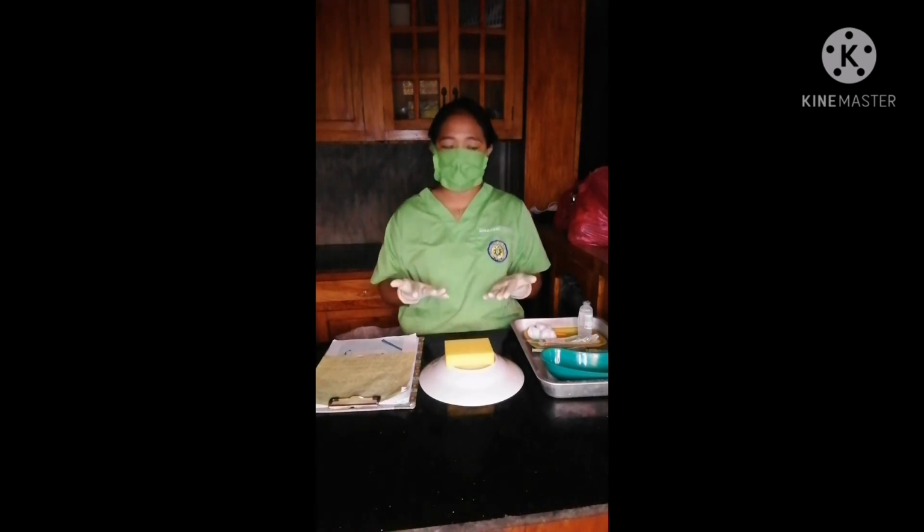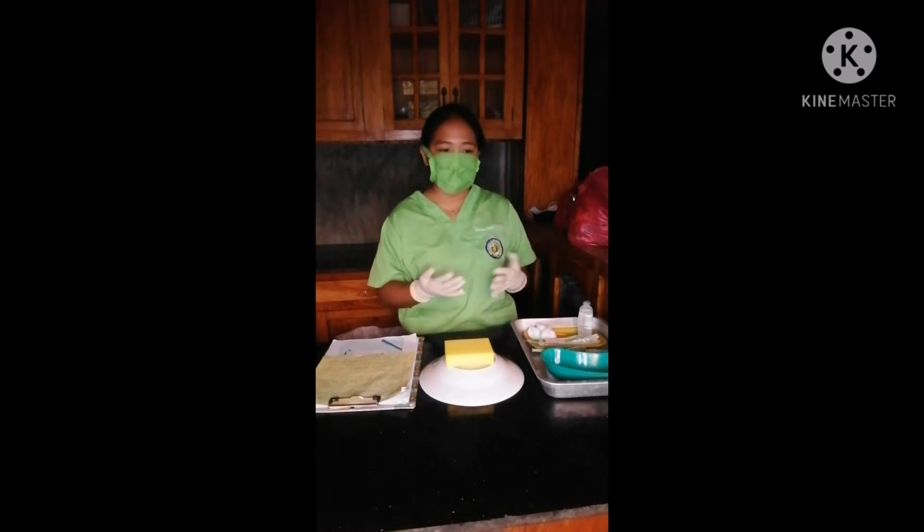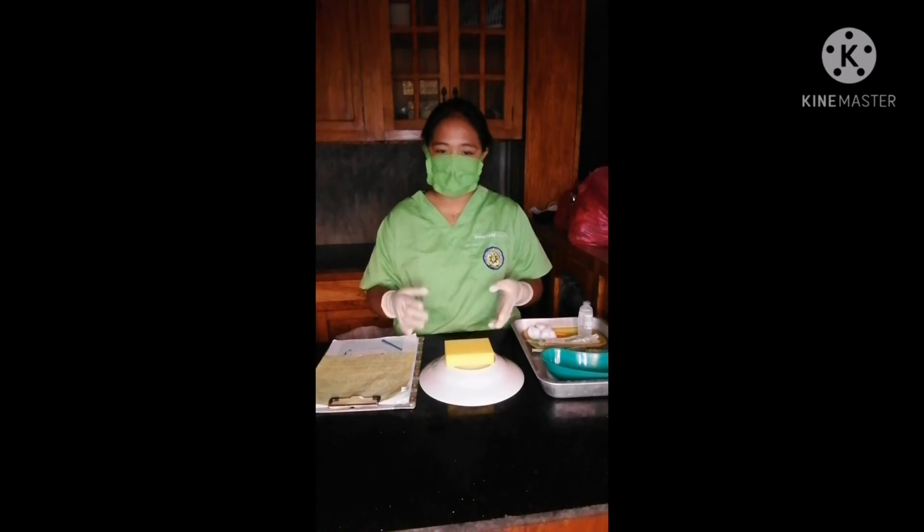Assist the patient to the appropriate position for the site chosen. Drape as needed to expose only the site to be used.